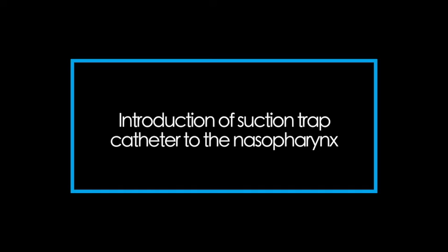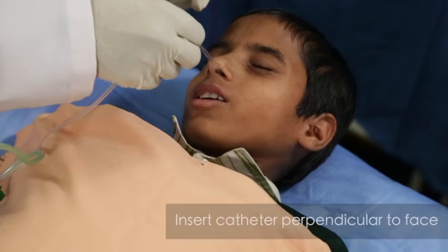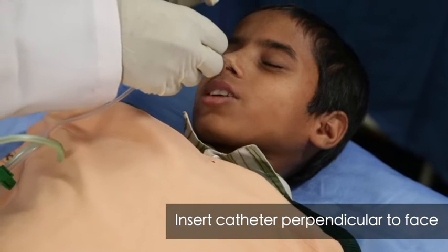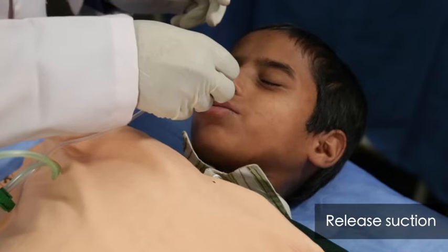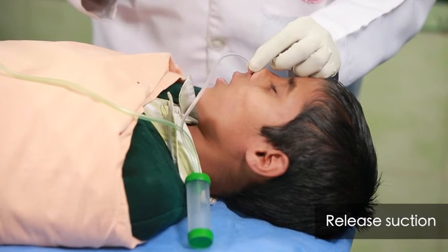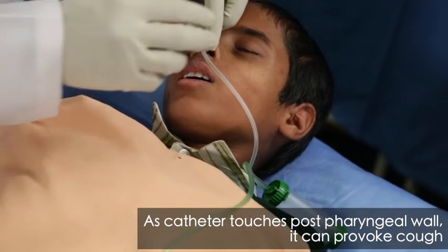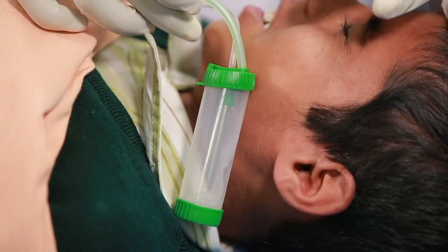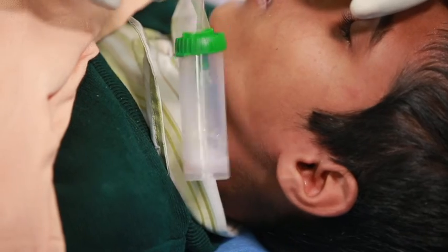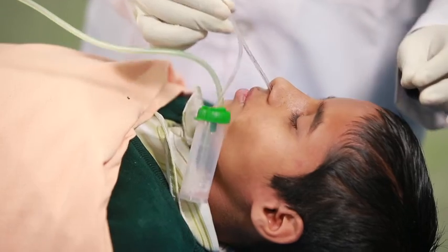Apply lubricant jelly or wet the tube before insertion. The catheter is gently inserted into the nose in a direction perpendicular to the face, then suction is released. As the catheter touches the posterior pharyngeal wall, it provokes coughing. The loosened secretions are brought up with the cough and suction facilitates their collection in the mucus extractor or suction trap.